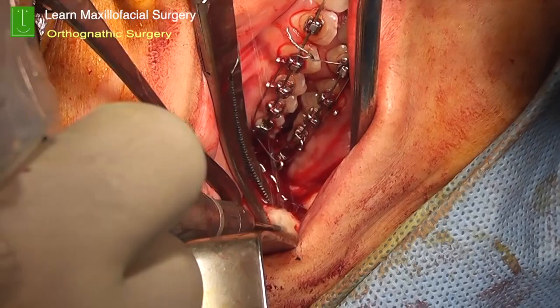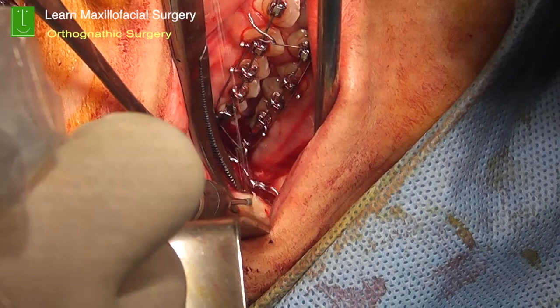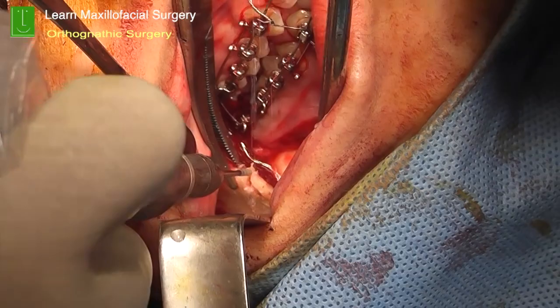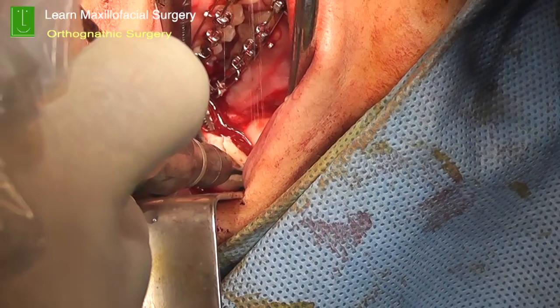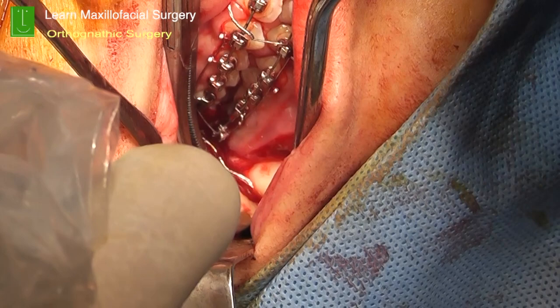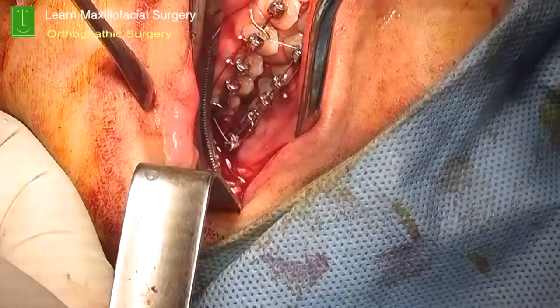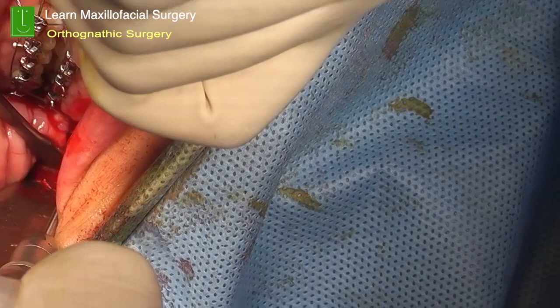And once this excess bone is removed, try the approximation onto the distal fragment. This is the proximal fragment. The bone is being removed from the proximal fragment. Again, it's a good idea to hold the proximal fragment with bone holding forceps or an artery forceps, and the edge is neatly cut off, right? So whatever excess bone is there when you set back the mandible needs to be removed. Once that is removed, you smoothen the lingual aspect, the medial aspect of the bone, so the approximation is going to be much, much better.